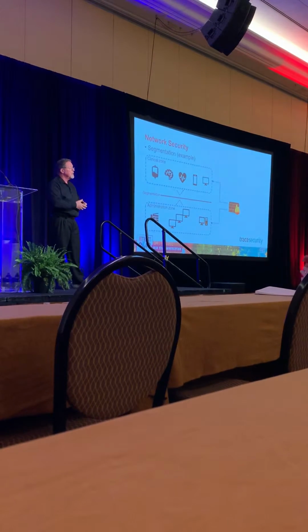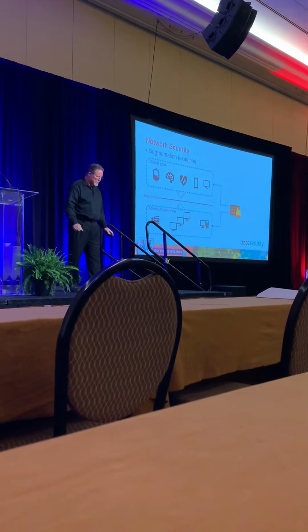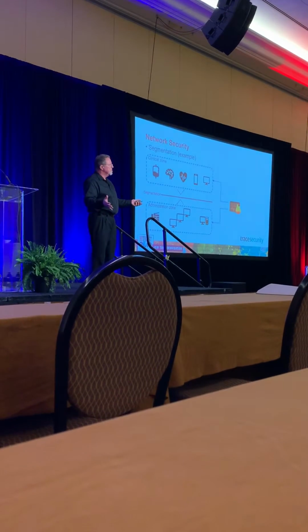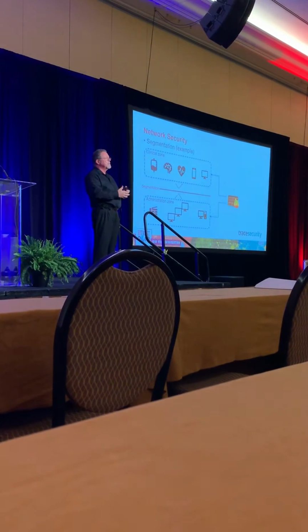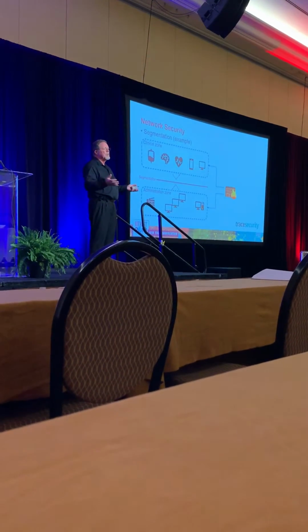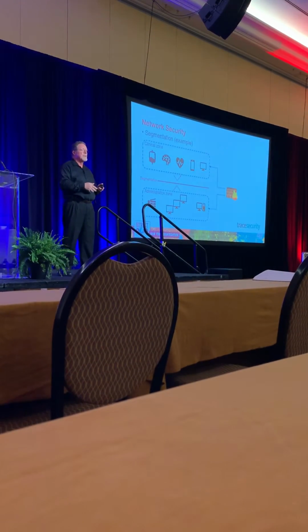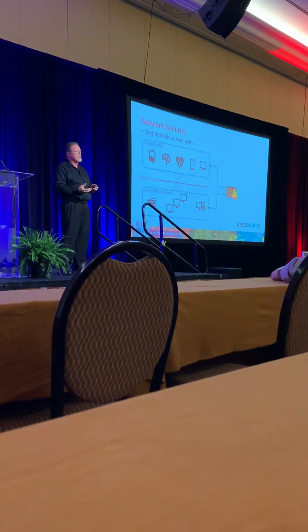I'll go ahead and jump over to the network side. Well, we're talking about devices, so why does the network matter? Well, no device sits in a vacuum. Any device connected to the network, wired or wirelessly, communicates across the network, sends data across the network, it's constantly in communication on the subnet that it's on.